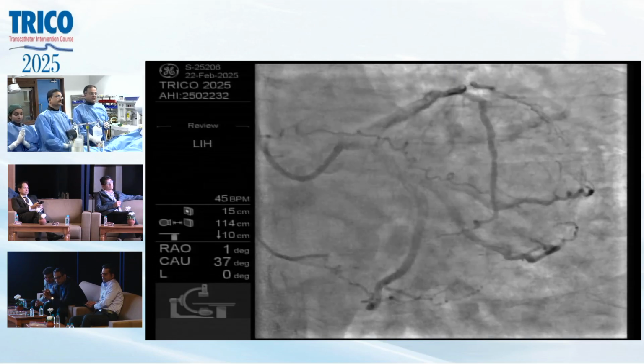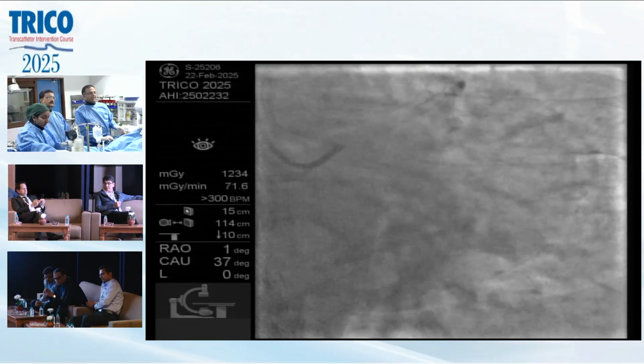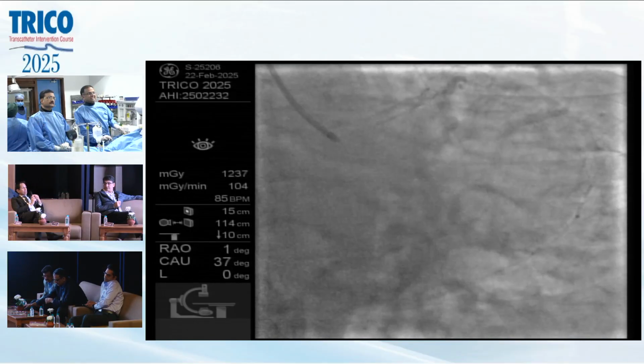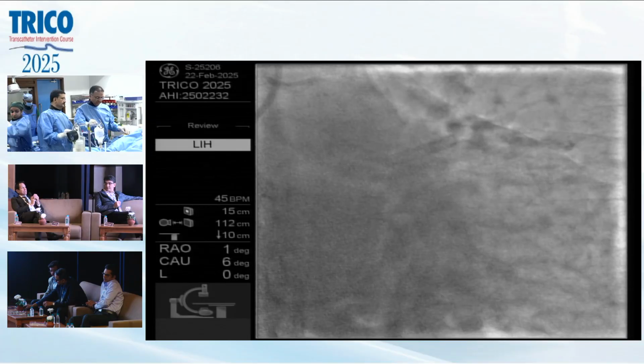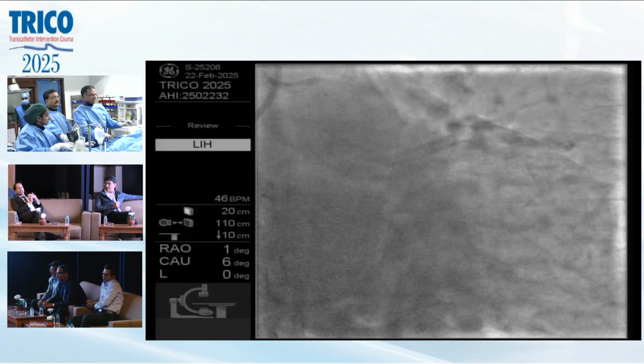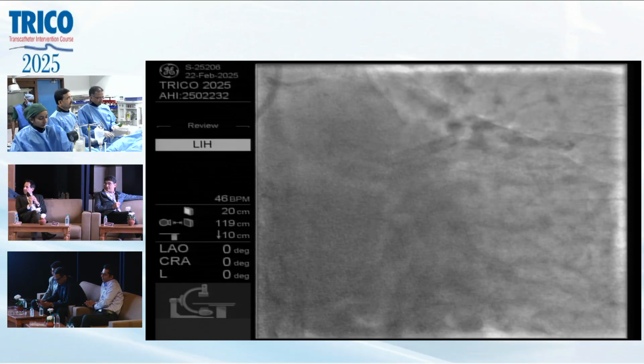It looks nice. Any other comments? Any wishes before we leave? I don't think so, Sam. I think that this went fantastic. Just maybe, and Tejas is here as well, your thoughts on keeping the patient in hospital overnight, or would you send him home this evening?